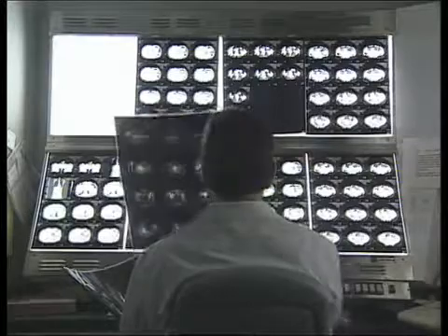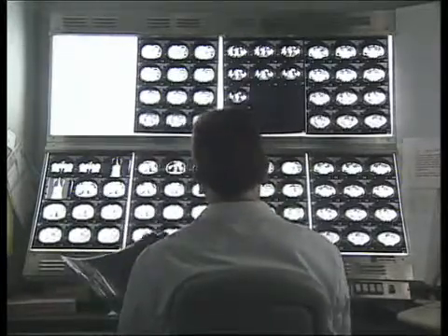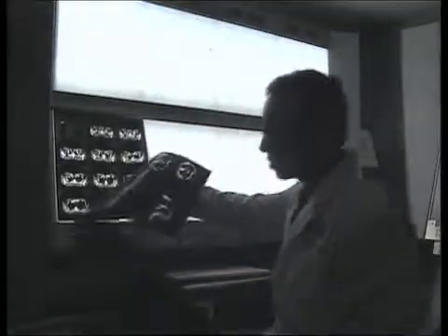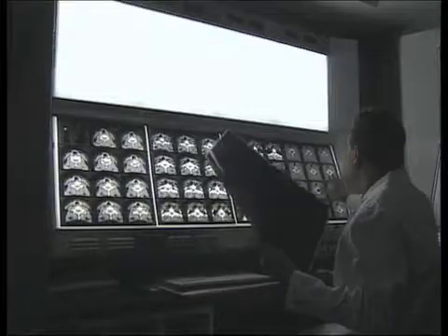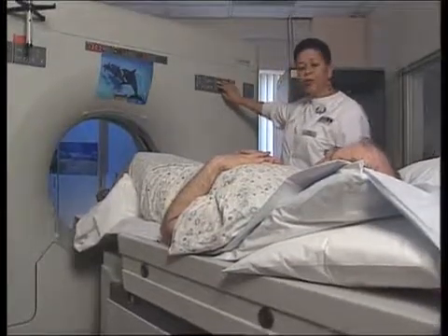One of these scans from the NSF is a patient with breast cancer.